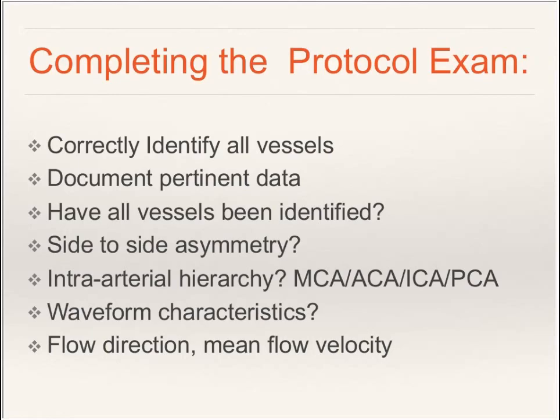So before you complete your exam, you want to make sure that you have correctly identified and labeled all vessels. You want to make sure you've documented all the pertinent data, that you have identified all the vessels, and if you haven't, you have to write down why. You know, the child just could have been difficult.